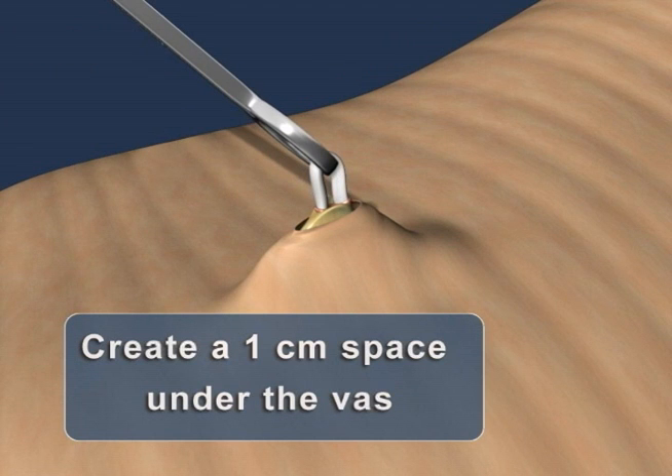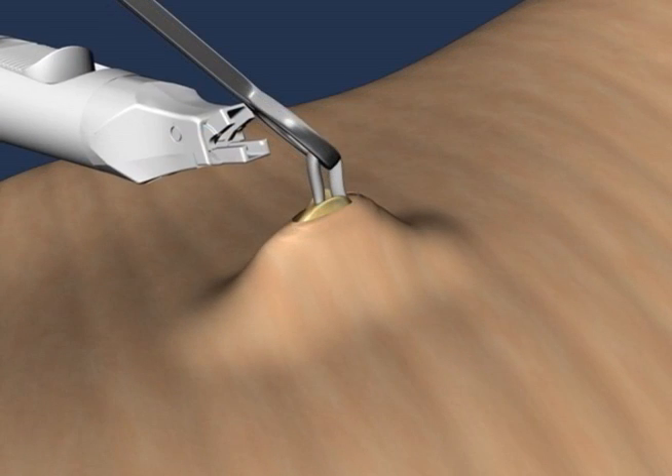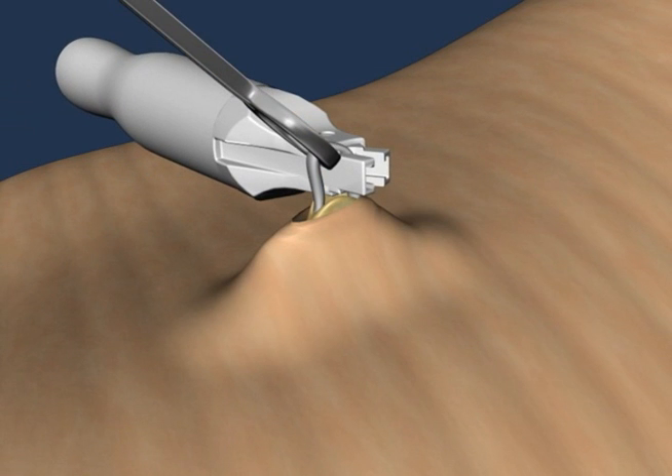Generally, a loop of 1 centimeter in height is sufficient to create a large enough opening. After inserting the lower jaw of the ProVas applier through the loop of bare vas, advance the plier forward until the vas is positioned at the back of the applier's jaws.